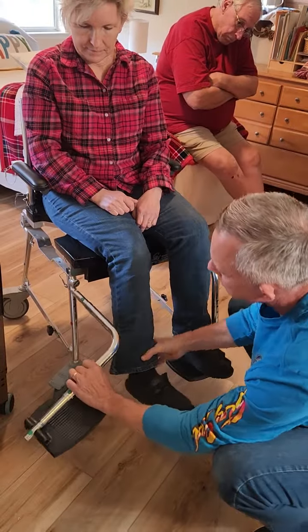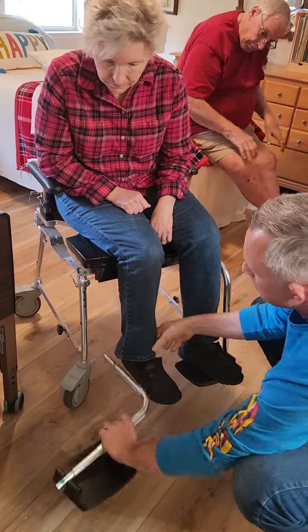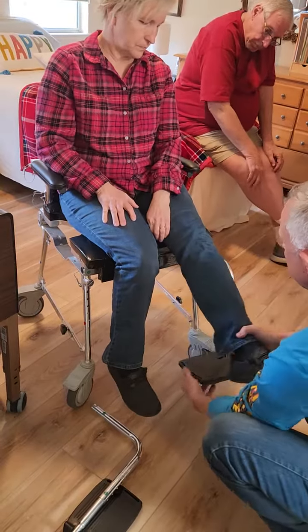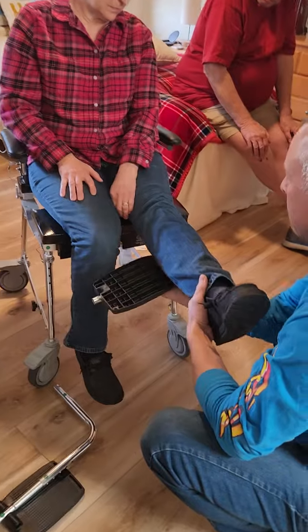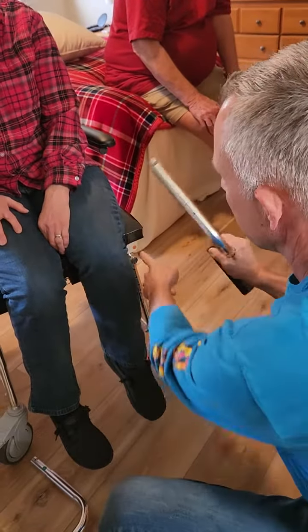Everything is color-coded, so you've got a green dot that goes with the green dot. On this side, turn in and pull out — orange dot to orange dot.